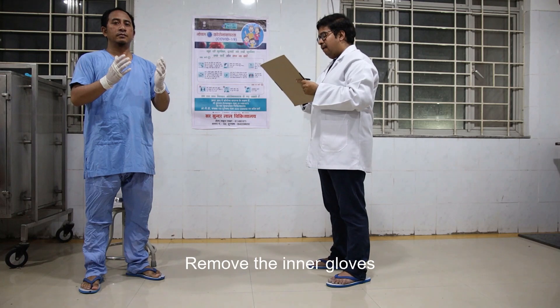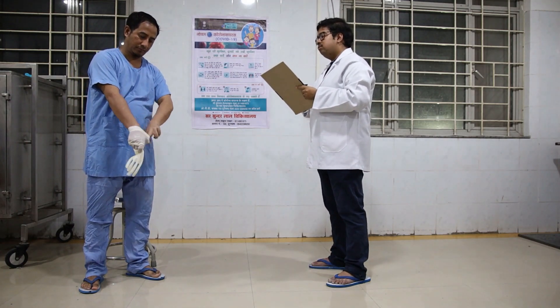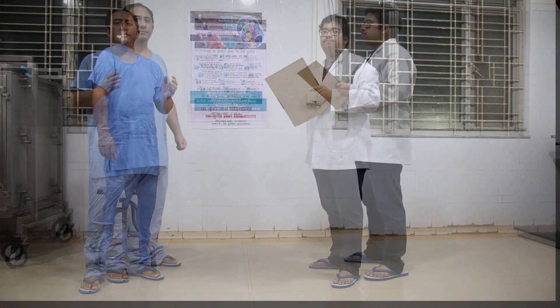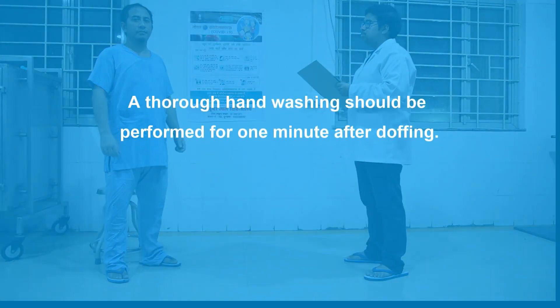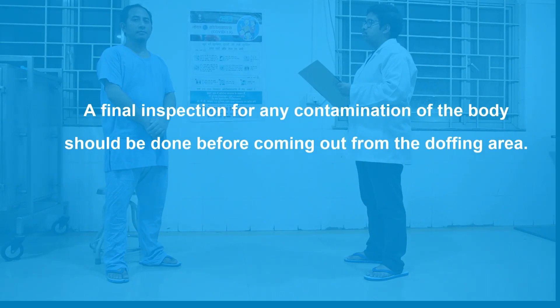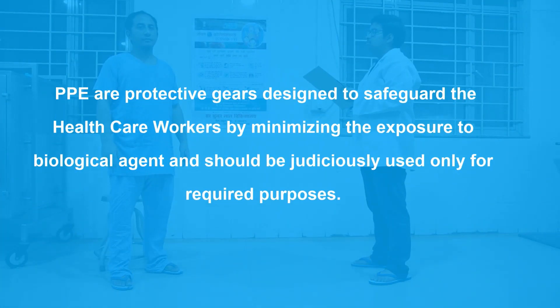Remove the inner gloves in the same manner as the outer gloves and discard them in the designated biomedical waste bin. A thorough hand washing should be performed for one minute after doffing. A final inspection for any contamination of the body should be done before leaving the doffing area. PPE are protective gears designed to safeguard healthcare workers by minimizing exposure to biological agents and should be judiciously used only for required purposes.